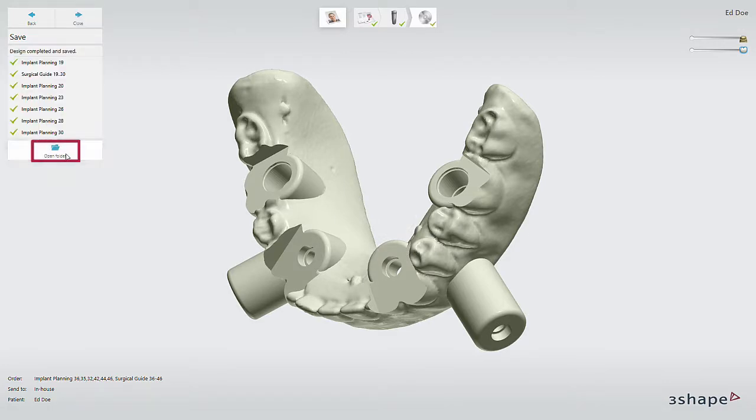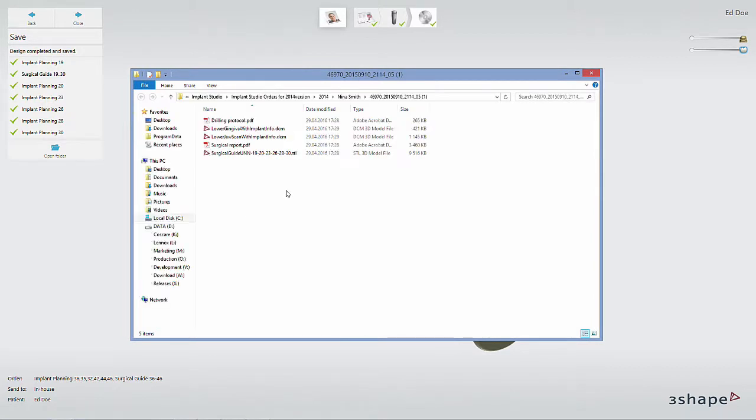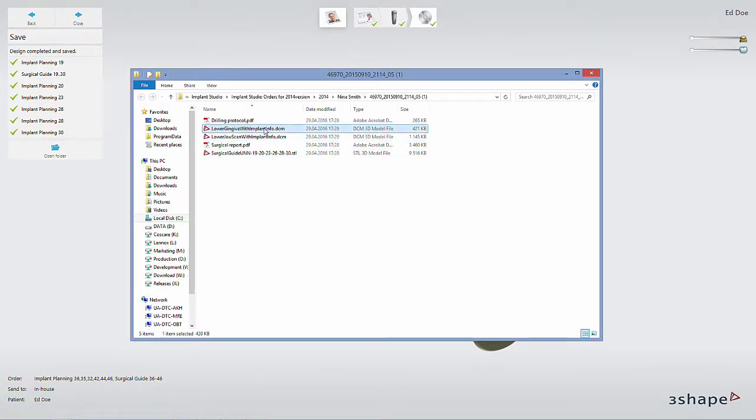The output folder will open and you'll find a DCM file called lower or upper gingiva with implant information. This file contains all information about the implant position and can be imported into Dental System to design the prosthetics.